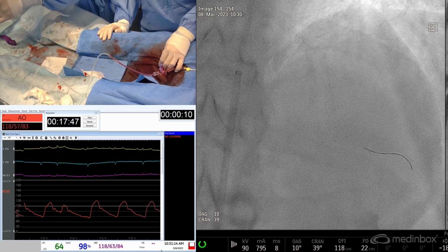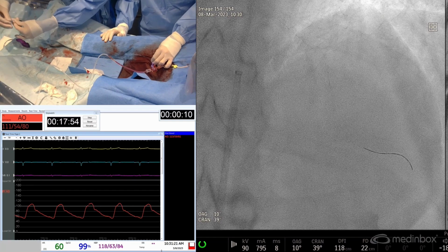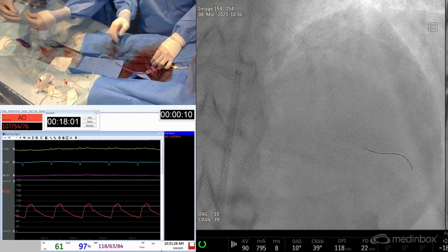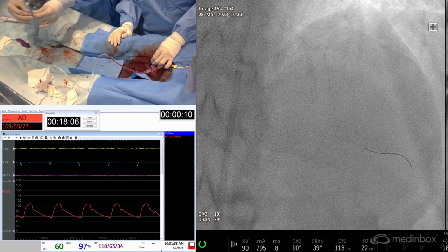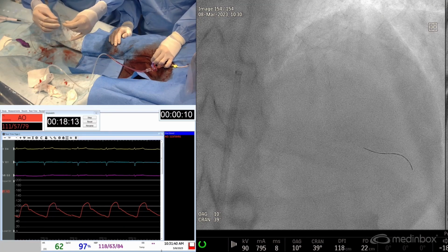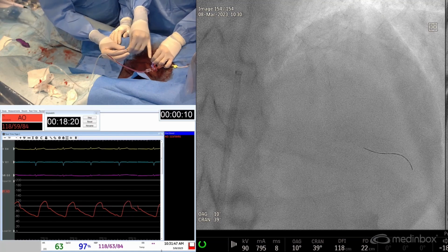So as you know, rotational atherectomy is the old dog on the field in terms of atherectomy, and it requires us to have some recipe that varies from operator to operator with the rotaglide, and some will add verapamil, nitro. Obviously, the ACT has to be kept closer to 300 than 250.